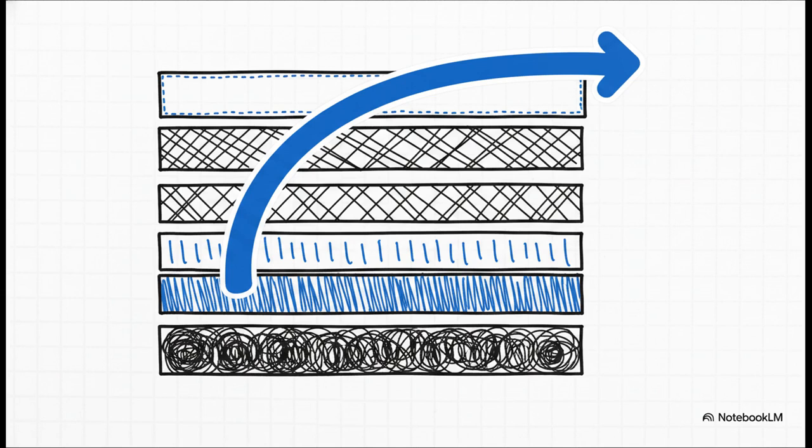To lock all of this into memory, the sources give us a fantastic little mnemonic going from posterior to anterior. "I can't see this stuff." Iris, ciliary body band, scleral spur, trabecular meshwork, and Schwalbe's line. So the pro tip here is if you ever find yourself lost or disoriented while looking into the angle, just recite "I can't see this stuff" to mentally walk yourself from back to front.